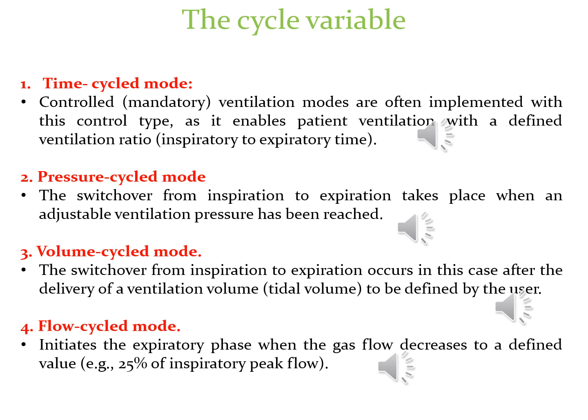Flow cycled mode. This control is primarily used for supporting ventilation modes and initiates the expiratory phase when the gas flow decreases to a defined value, for example 25% of inspiratory peak flow. The start of inspiration is mostly initiated by a patient activity and on reaching a trigger criterion.